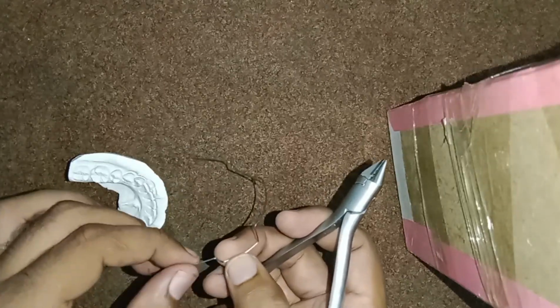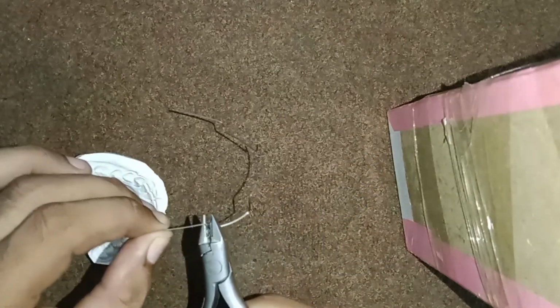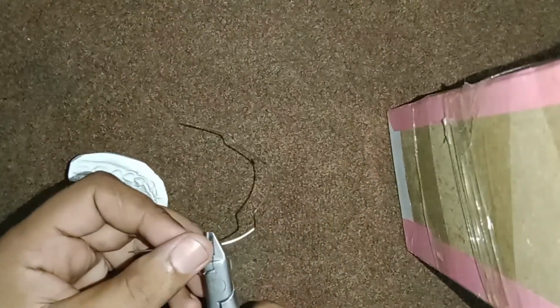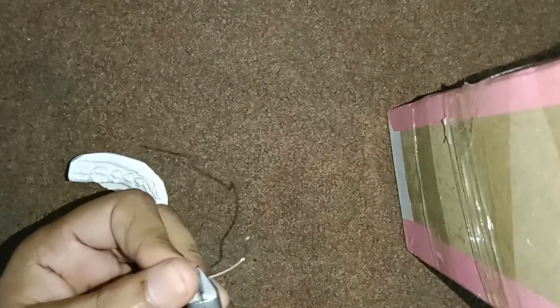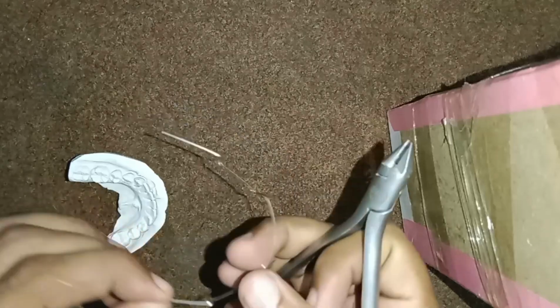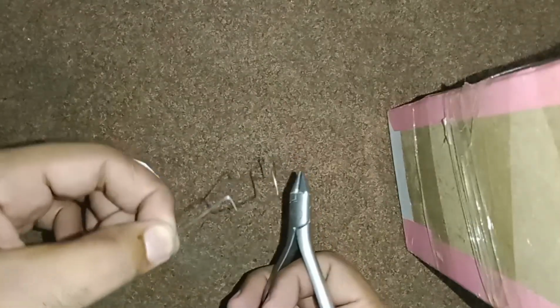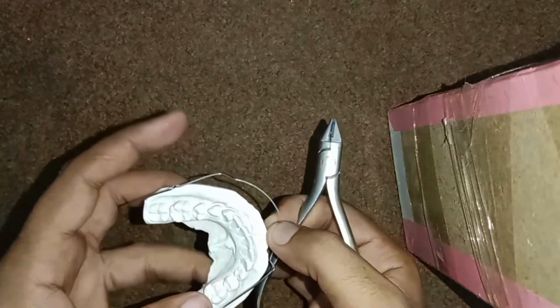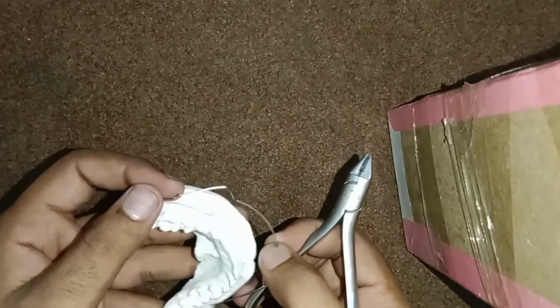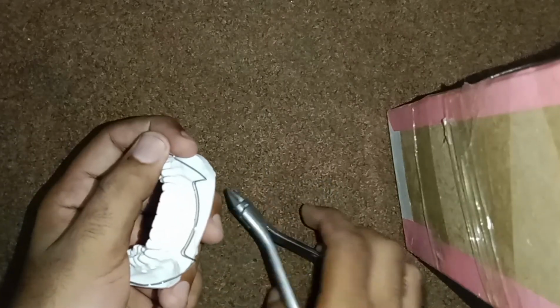And now for the activation of the intrusion arch, we will hold the wire at this point and give it a downward 25 degrees bend on both sides. Both sides we will give a downward bend of 25 degrees. Now we will pass this wire into the molar's accessory tube. The wire will lie downward in the anterior section.